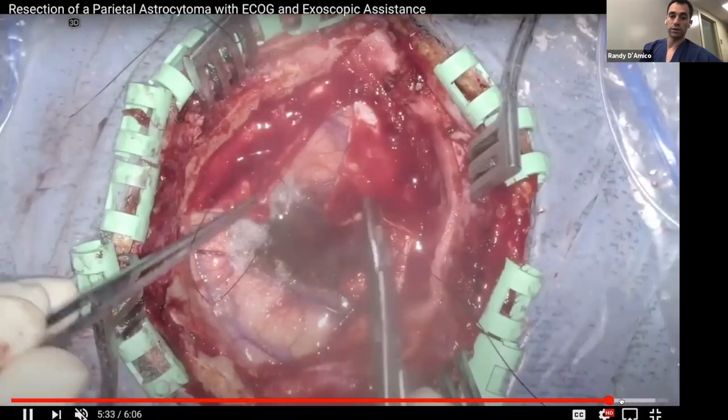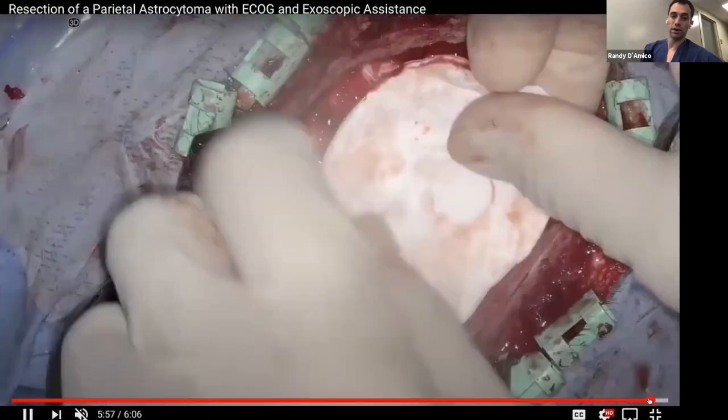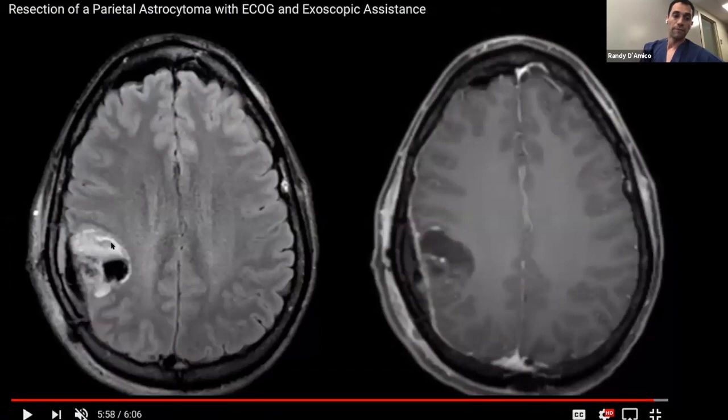Then you reapproximate the dura with some stitches. You put the bone back on, and this is our post-op here. You can see this was a pre-op FLAIR image. So again, FLAIR bright, this is the old biopsy site. And this is a post-op image. And you can see that's a blood vessel on the front. This is probably just hemostatic material in the back, and you know, it's gross total resection.